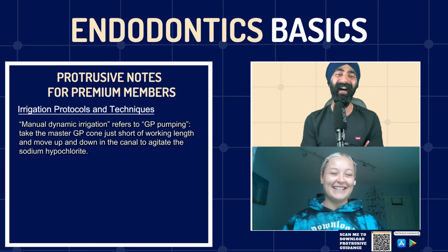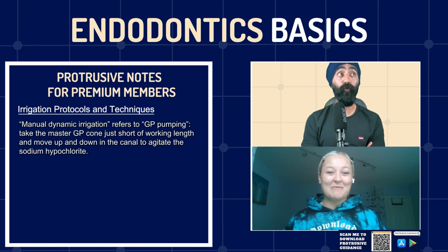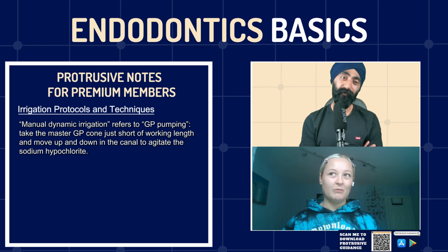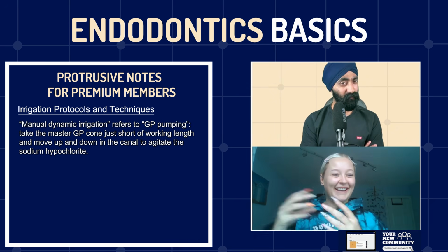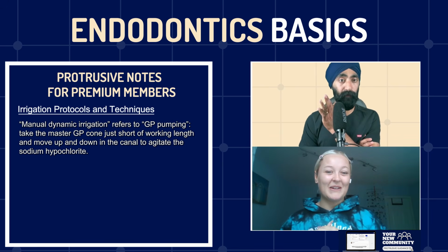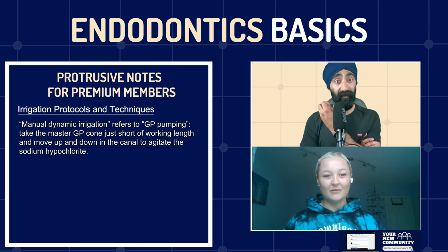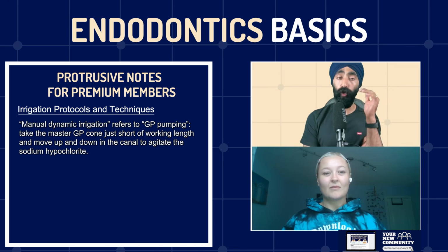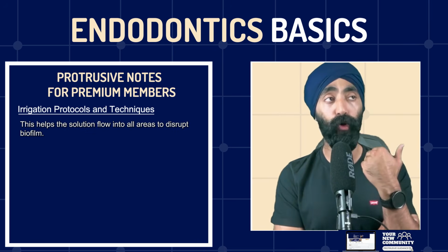Agitating the irrigant inside the canal just to clean. And how do you do that? What techniques have you been shown? We've been shown using your GP cone, but we don't have them in Glasgow, not for the students anyway. But you can get specific agitation tips, like ultrasonic tips and that kind of stuff too. Yeah, the ultrasonic one totally has a very good evidence base in terms of being effective, and it's amazing how much cleaner your canal looks by using this. So endodontists are very pro ultrasonic agitation of your irrigation protocol.